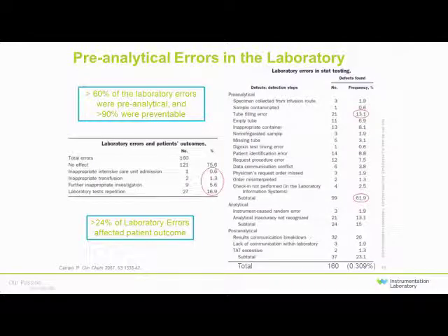If we look at all pre-analytical errors in the laboratory, there was a study published from the University Hospital of Padova in Italy looking at their STAT laboratory. In 3 months, they reviewed over 51,000 analyses in their lab. They determined that 61.9% of all errors were pre-analytical, and most of those, 13.1%, were tube-fill issues.